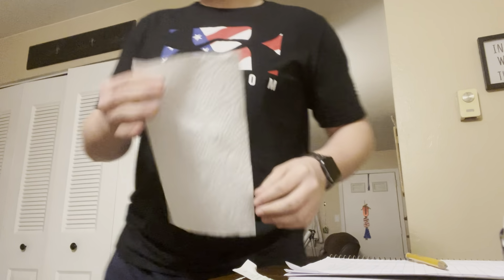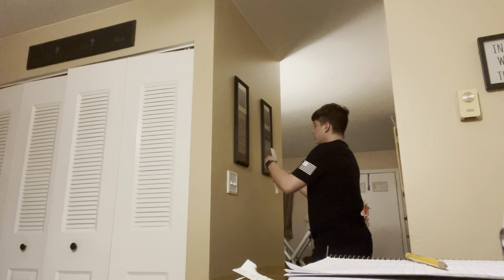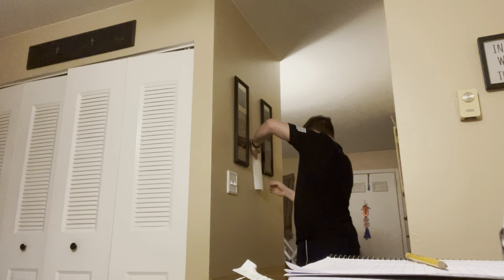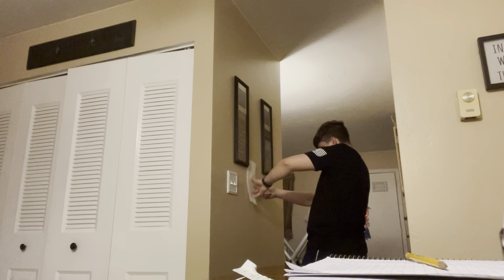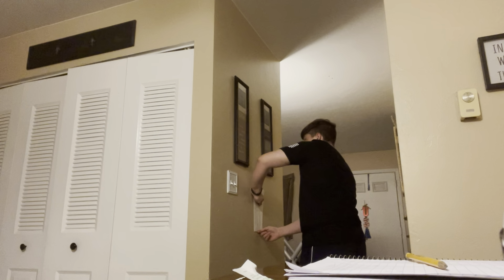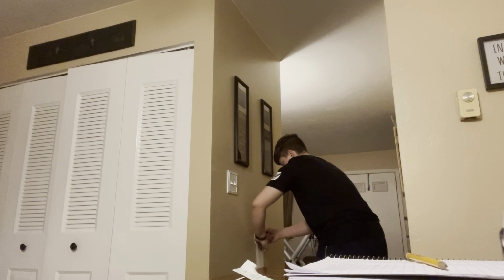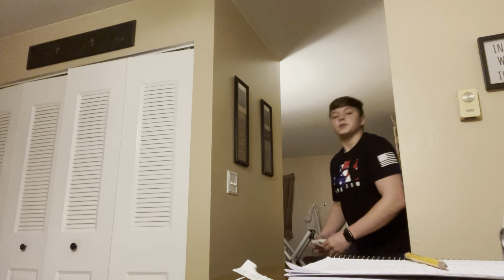So these are exactly 12 inches. I measured with a ruler. And I'm going to try and read off. If it reads to about 5 foot, it's about as accurate as it's going to get. Keep in mind, this is only a little simulation. The line starts here, ends right there. Press this, begins anew. We'll come to exactly 5 foot.